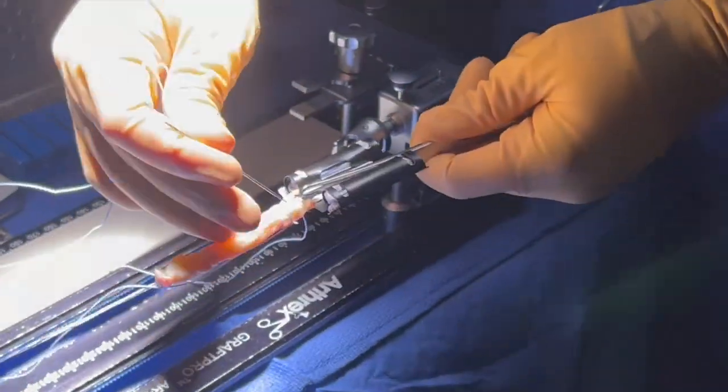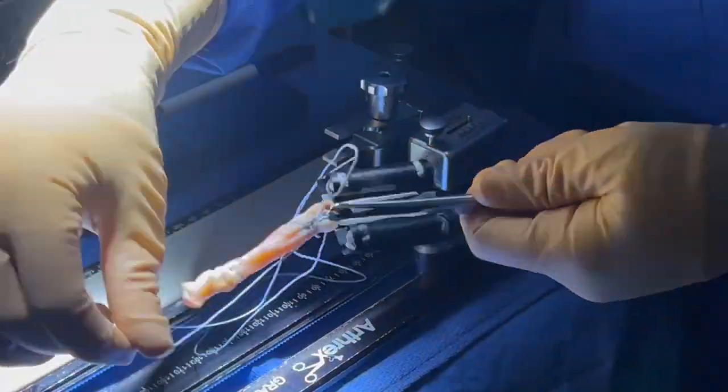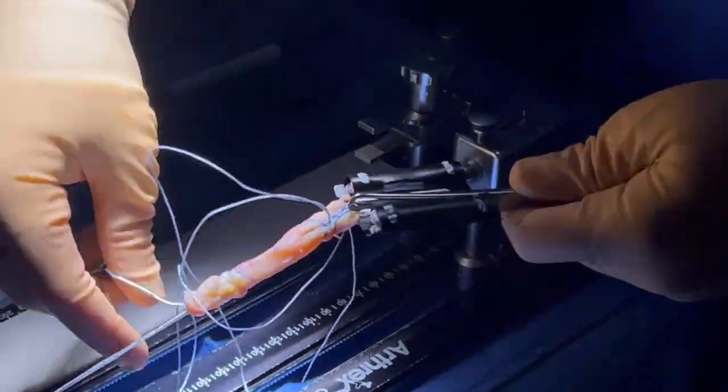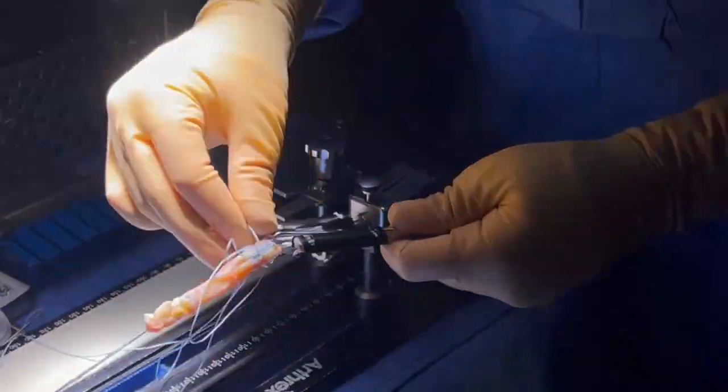And then we place a few more passes looping the suture around. This integrates the tape well into the quad tendon and allows for robust fixation.